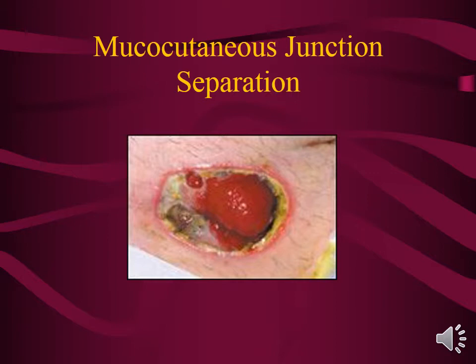And we would just be watching that so that that would heal in, and then we would monitor it until it all filled in, granulating from the bottom up, and of course monitor for any signs of infection. Right now it's just in the inflammatory process, but that's what it is, just separating the wound edges.